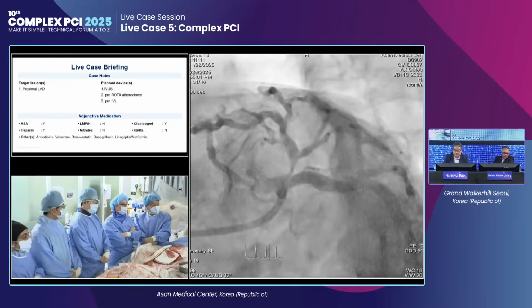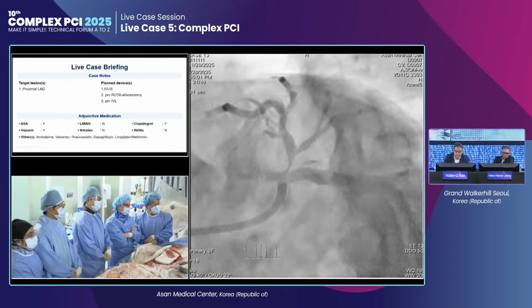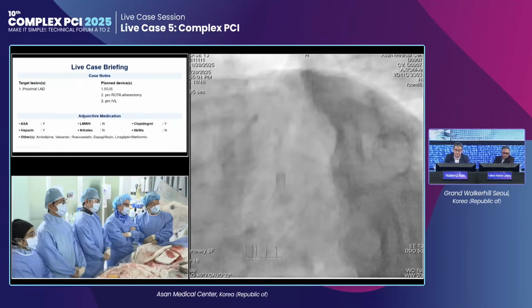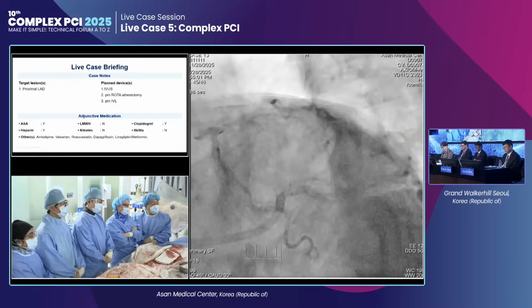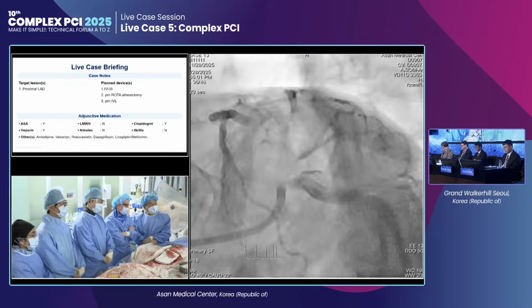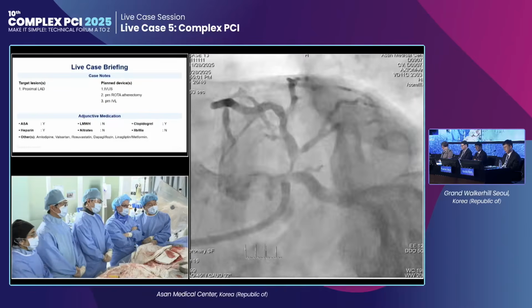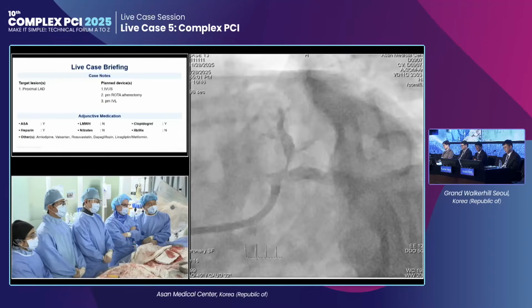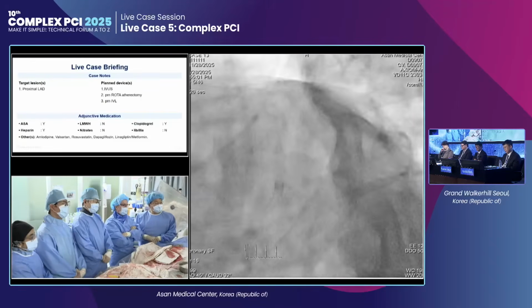Definitely if we go to place a stent, we try to be precise at the ostium of the LAD. The left main is super short, it is huge. We will not anchor the stent in the left main, which will give too much distortion. And we will go right distal to the diagonal. The problem here is calcified, but doesn't look tremendous. But we did the IVUS, we pre-dilated the diagonal and the LAD, and we did IVUS.